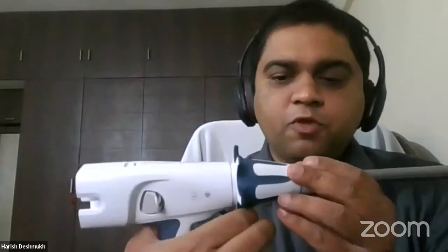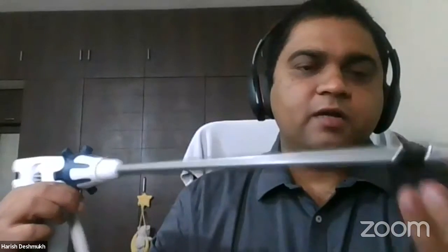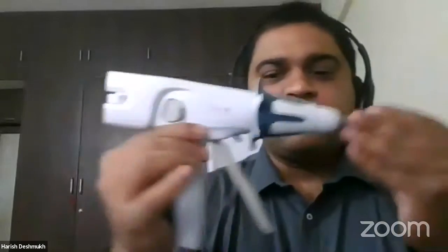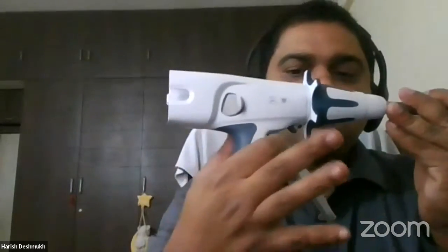Thirdly, the shaft length. Then we have these articulating fins. These fins help in rotation through 360 degrees. Also, when you pull these fins towards yourself, the articulating joint becomes free and lets you rotate whichever way you want, to either side. Once you want to position it at one place, for example like this, you have to release the articulating fins. Then we have a closing trigger.